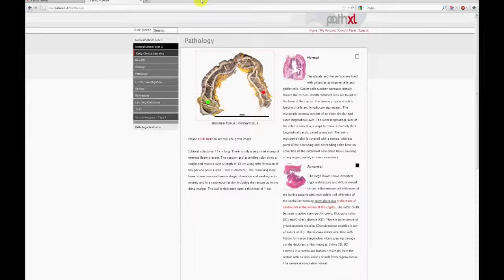This rich approach to learning enhances the student's understanding of disease in its broadest context, and gives you the flexibility to integrate media of all types: documents, PowerPoints, lab reports, x-rays, photomicrographs, and digital slides, in order to build powerful interactive materials for all types of pathology-based teaching.